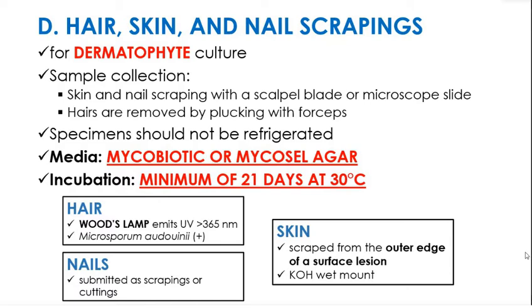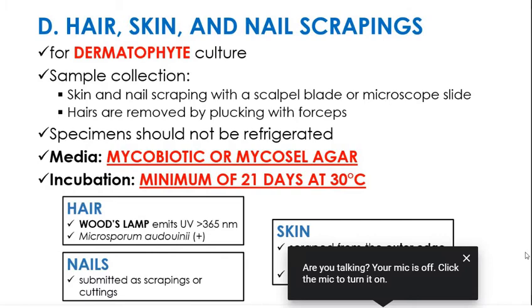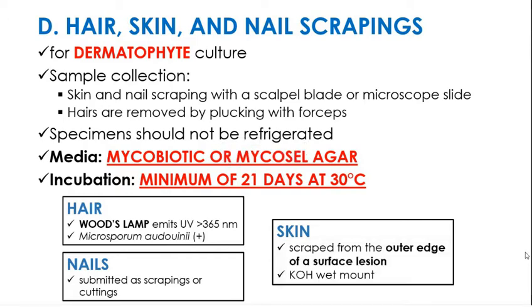Pag ang specimen natin ay hair, skin, and nail scrapings, even if we say that the general or primary media for fungal isolation is your SDA, pag dermatophytes na, we have also your mycobiotic or your mycosel agar or we have other DTM agar din, medium din for dermatophytes, dyan sa ating hair, skin, and nails.